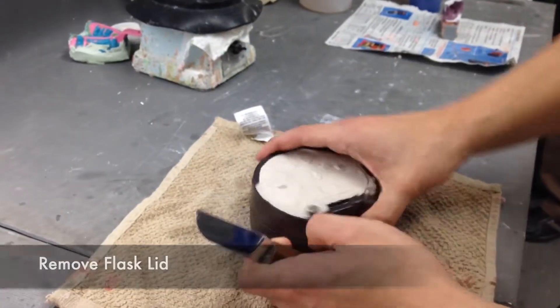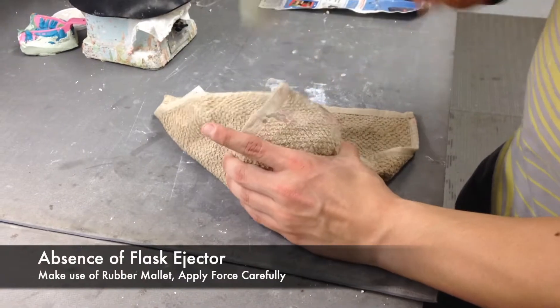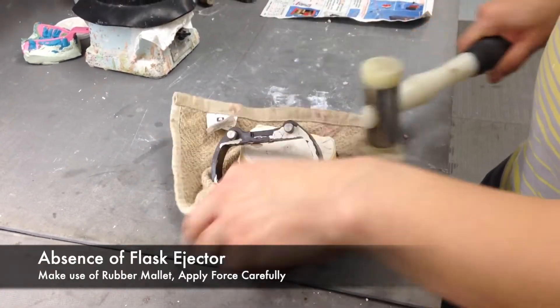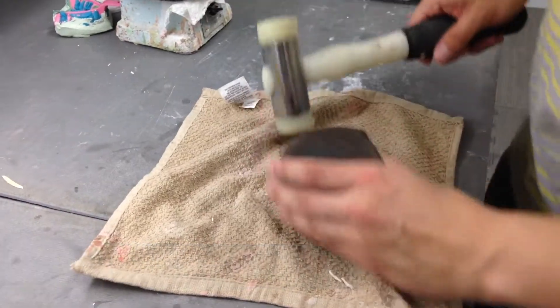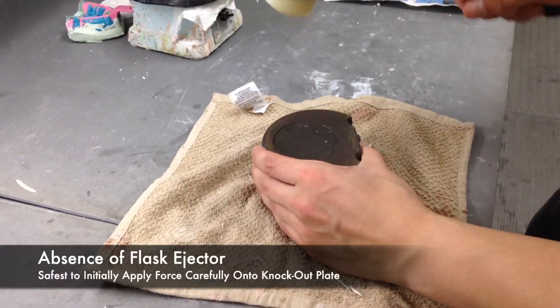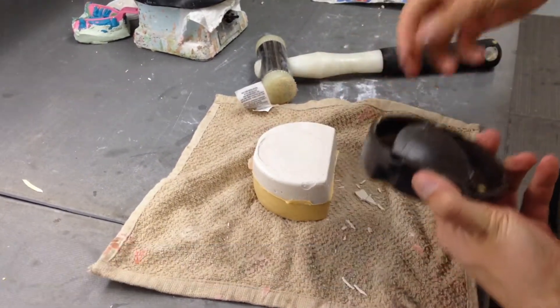Although the Air Force Manual advises the use of a flask ejector, many times in laboratory settings you will find yourself without certain equipment. In the absence of a flask ejector, be sure to use a rubber mallet with strategic force. This will aid in retrieving the stone investment from the flask without damaging the denture inside.